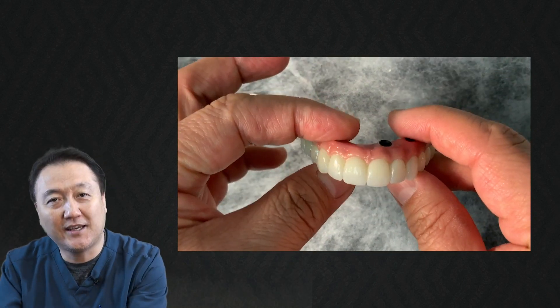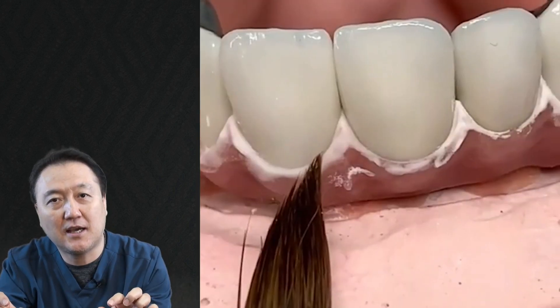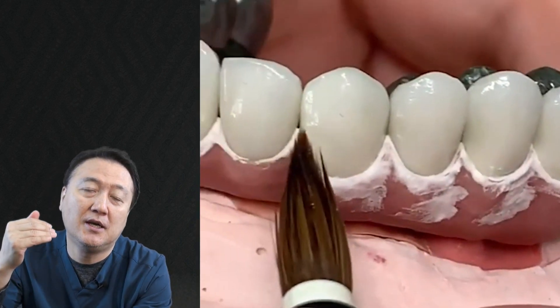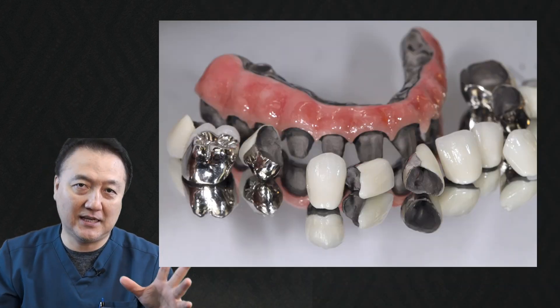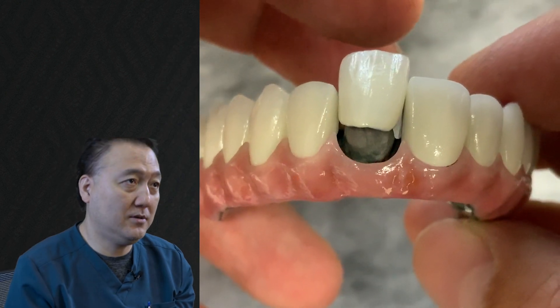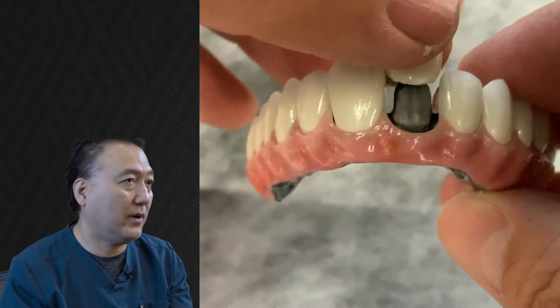Number two — not only do we make it for hygiene, we design the frame and put porcelain on the outside, which is porcelain-fused metal, also called ceramic. You don't get much stain, you don't get much dirt. It's very nice. And how can you repair it? Easy — grind it, put the ceramic primer, add composite. It's Gradia from GC America, so you can patch it right away.